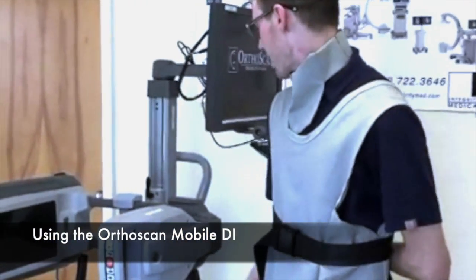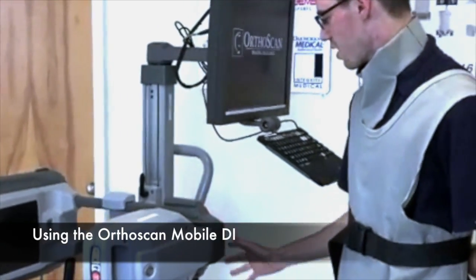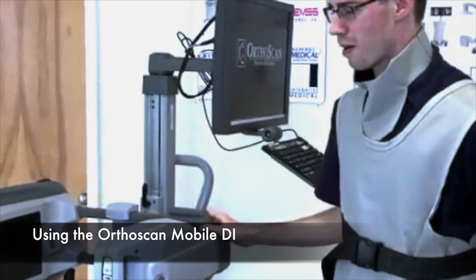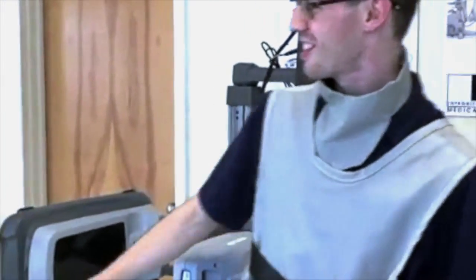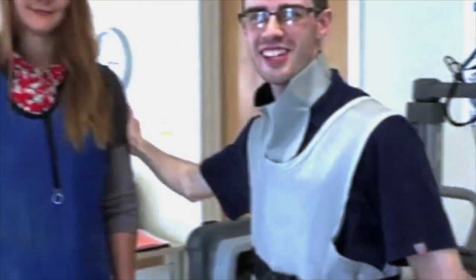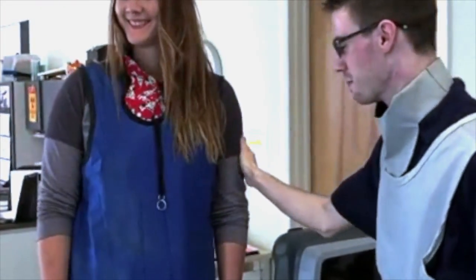Hi, this is Andrew again. Now that we got the C-Arm onto the stand, we are going to show you how to properly use it. Our volunteer here, Chelsea, is going to let us do an x-ray of her hands.